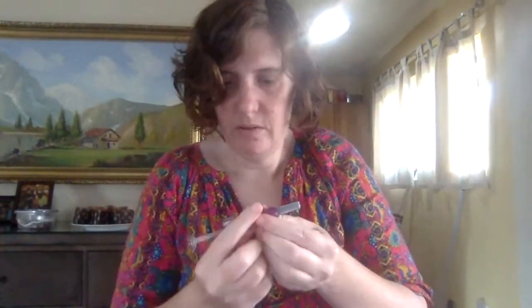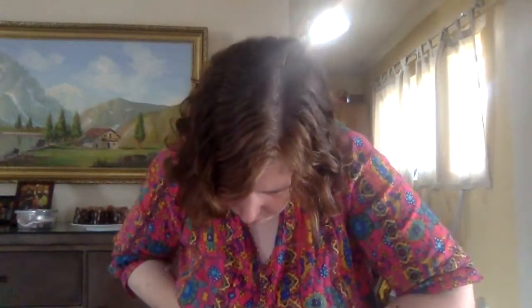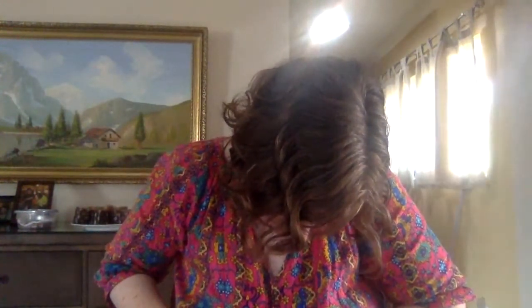No accessible tab for your paper. Yes, you have to find it from the edge. Angle for... Don't hold the wings, hold it at an angle, pull the cap. This time I'll pinch and go. It went in faster. Okay, go the plunger in. It really is easier if you just go fast.